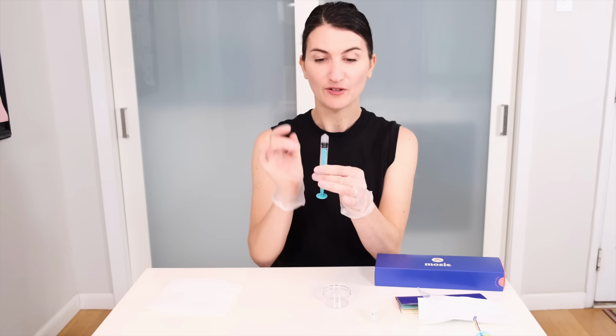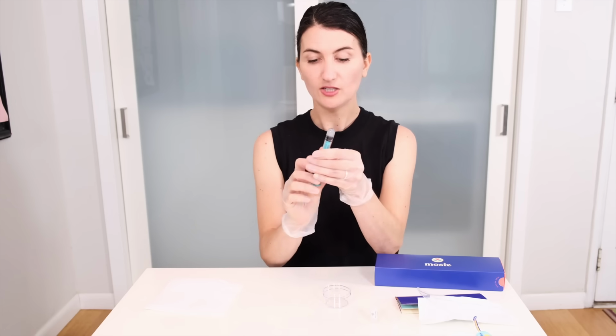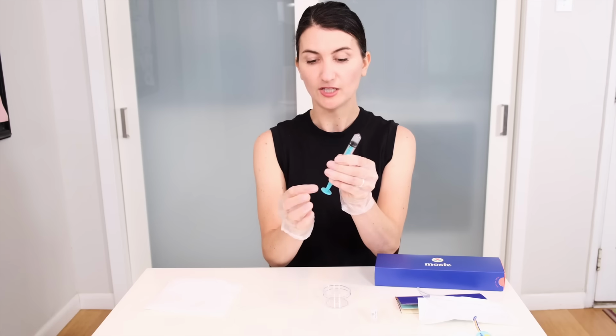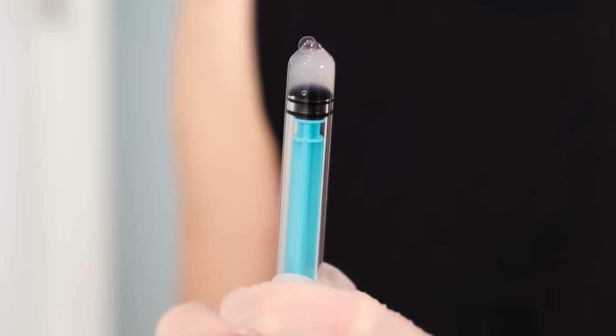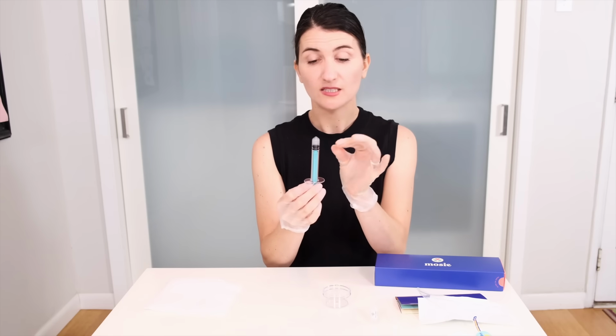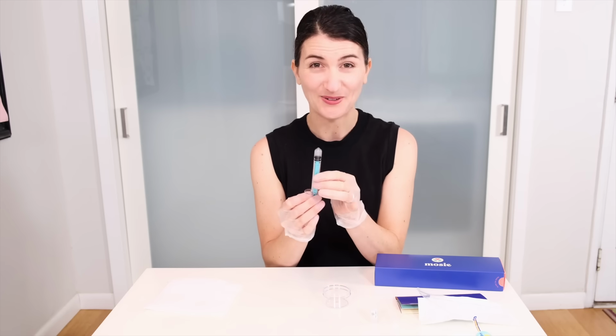If you do get an air bubble, know that that is okay. Even people in doctors' offices get them. You will just want to flick it, perfect, all the way to the top. And if you need to, you can very gently take the syringe plunger here and just push it right up to the top. And it is out. If by chance you push just a little bit of semen out, that's okay too. You're doing your best, you're human, you got this, you're gonna be okay.